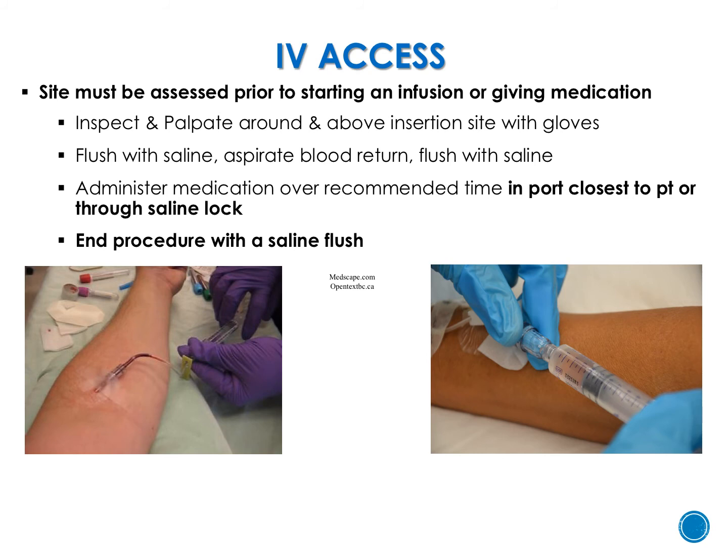The way that you do this is you start out with inspection. You're visually inspecting the site. You're looking for any redness, swelling, or drainage around the site. Then you will put on gloves and palpate, actually touch above, below, and the sides. You're feeling to check the temperature, to see if there's any warmth or if it's excessively cool.